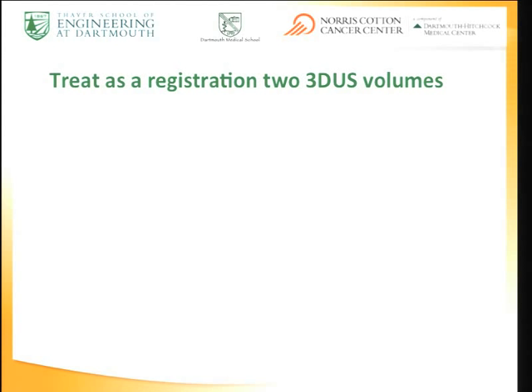There was always correspondence there, but we had far fewer features. We did some things. It worked all right, but not nearly as good as this. This is actually pretty neat, and I think it's because of the 3D information. Again, it's predictable, it's reliable, and you can use it to get this displacement map and follow it over time. So I won't show you any of our work trying to register ultrasound temporally back to MR and then extract the differences between those two registrations, ultrasound here back to MR and ultrasound later back to MR, that difference we were trying to use as a displacement field. Again, it was really limited and didn't work. It worked okay, but not as well as this.